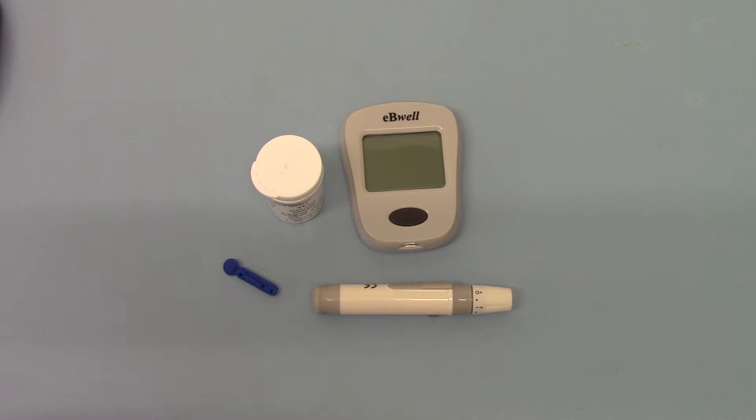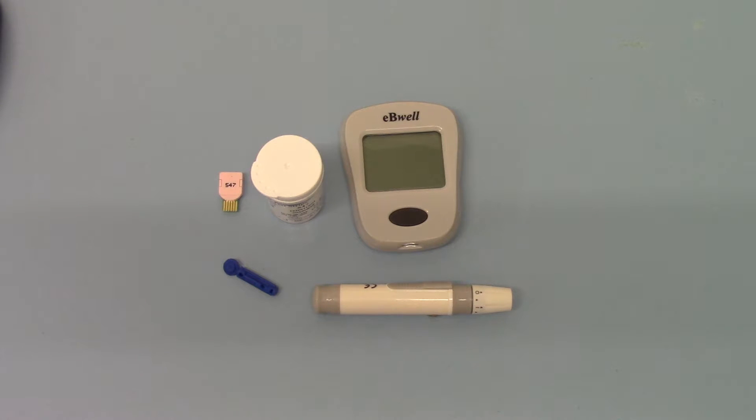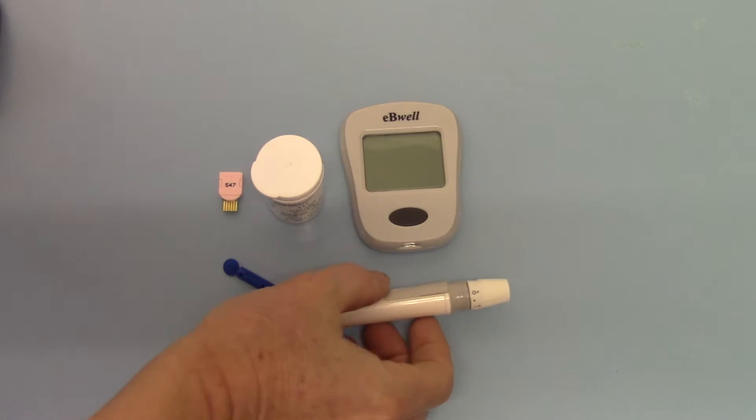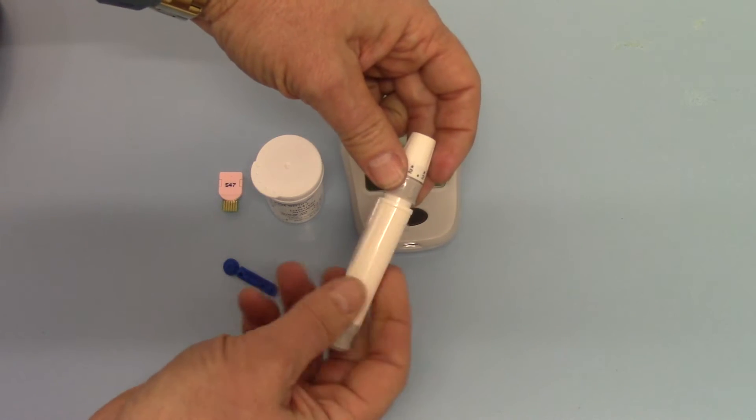This meter has also been coded with the 547 code chip in the last video so it's got all the information on board ready to do a test. Now what we're going to do here is demonstrate the auto lancing device and how to prime that.